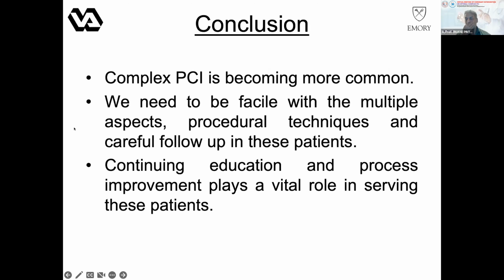Gautam, I have a question. You mentioned the post-PCI FFR and how we're often leaving patients behind. What I found in my post-PCI FFR with iFR pullback or resting index pullback is it's very often diffuse disease, and not necessarily the stent, but disease that was angiographically inapparent. I always feel bad when I leave a case like this, but should we be putting in longer stents? Should we be making the FFR or the resting index 0.89, or should we be leaving the disease alone? It's always a conflict.